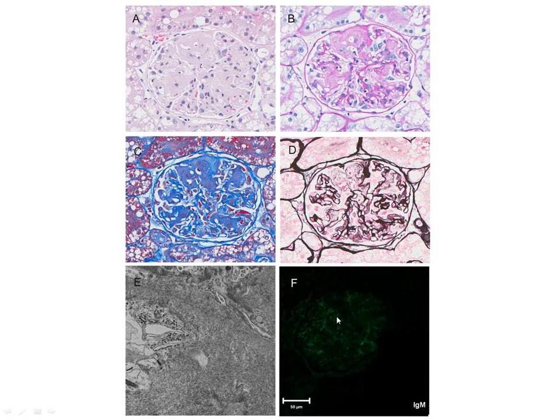So even though if you just see a little bit, like if it's definitely immune complexes, you're going to see the most beautiful granules you will ever see. But this is routine. This is the glomerulus from this exact case where we just saw this kind of hazy, non-specific staining pattern.